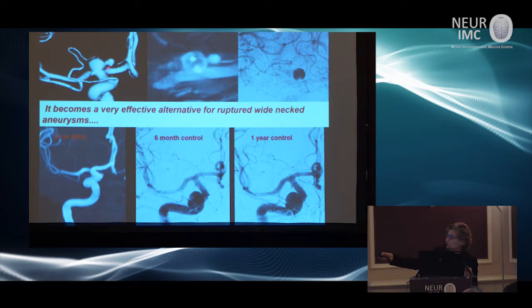This was a ruptured case too. And at the ICA terminus, you may have worried about protruding coils into the parent artery, but with the WEB device, very good contrast stagnation. This is for our curiosity, basically 24-hour MRA and 6-month, 1-year control, very stable result.